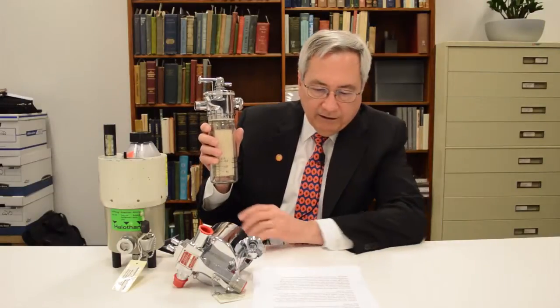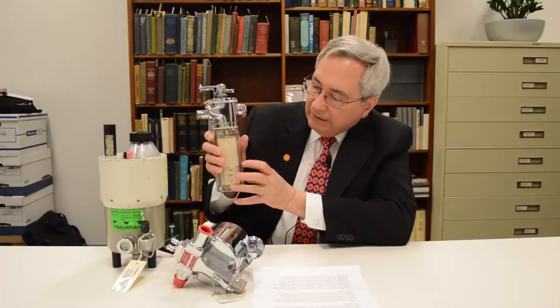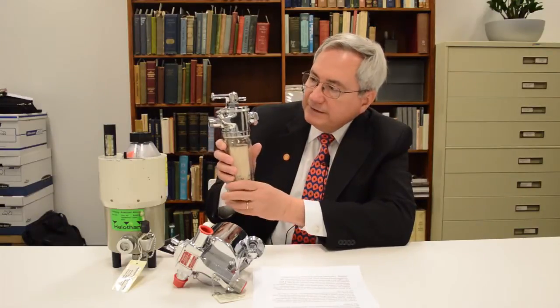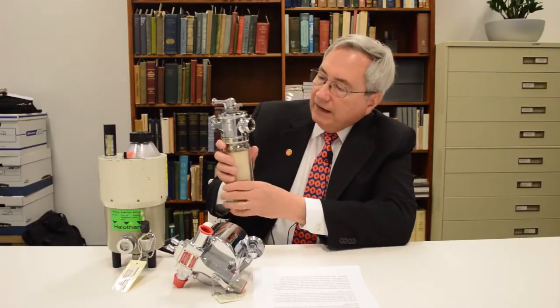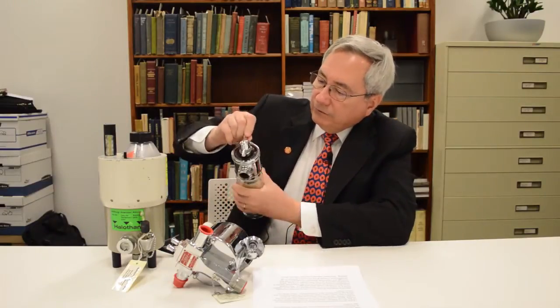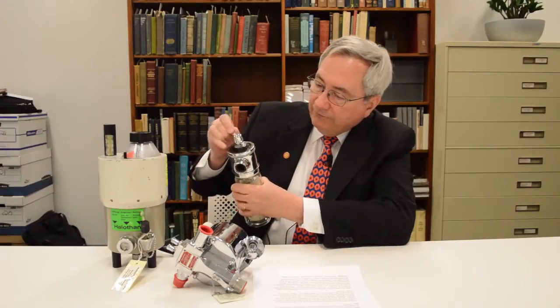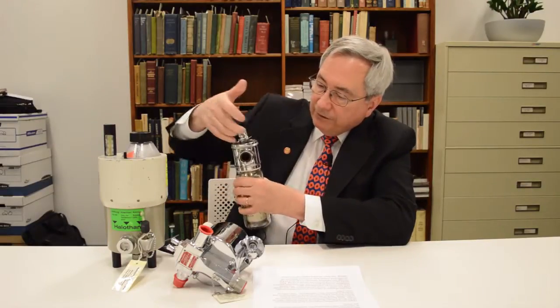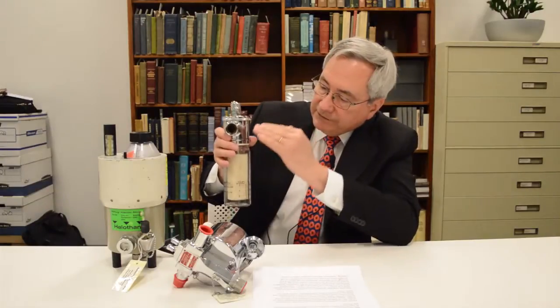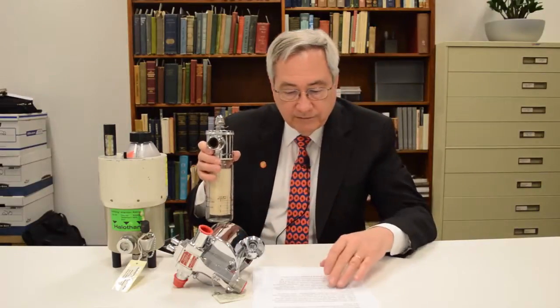The wicking then would provide a surface for that anesthetic to be volatilized. The anesthetic gases would flow through, and a control valve at the top could be adjusted to allow varying amounts of flow to go straight through versus flow that would go down, pick up the anesthetic vapor, be blended, and then delivered onto the patient.